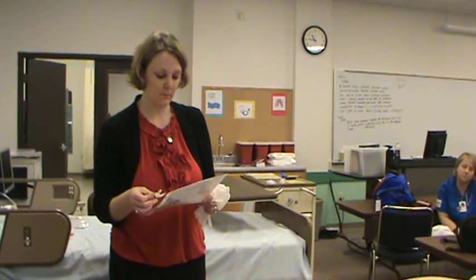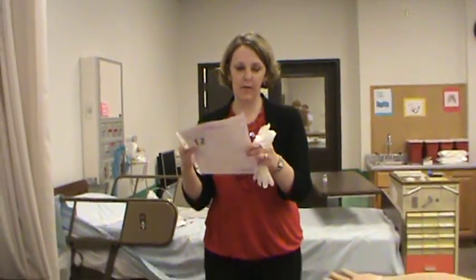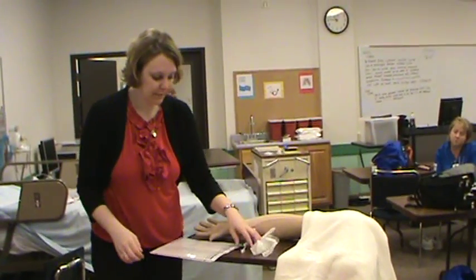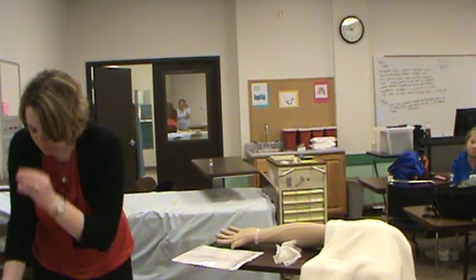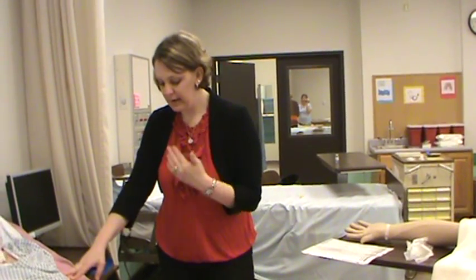Administer intradermal injections. Carry medication to room, introduce self and identify client by matching name band with the MAR, and explain procedure. So again, I'm going to the patient's room with my medication, an alcohol wipe, my gloves, and the medication administration record. I am first going to verify that I have Lydia Ocampo, and I would introduce myself to her. I would say, Lydia, my name's Natalia, I'm going to be your nurse.